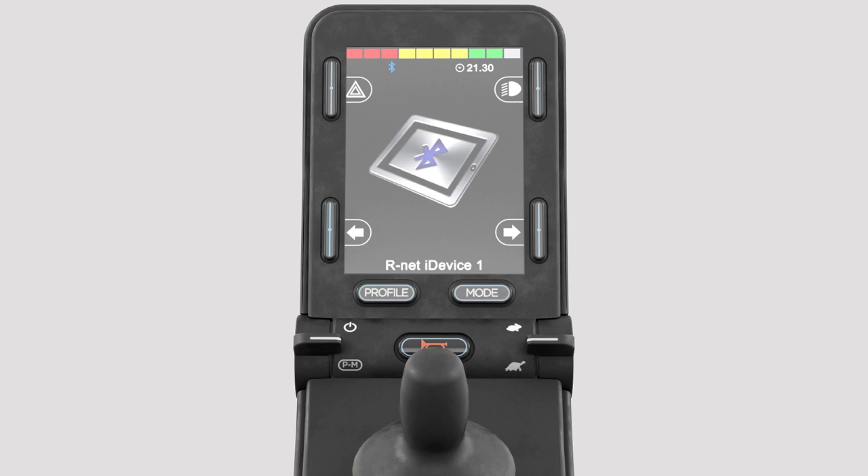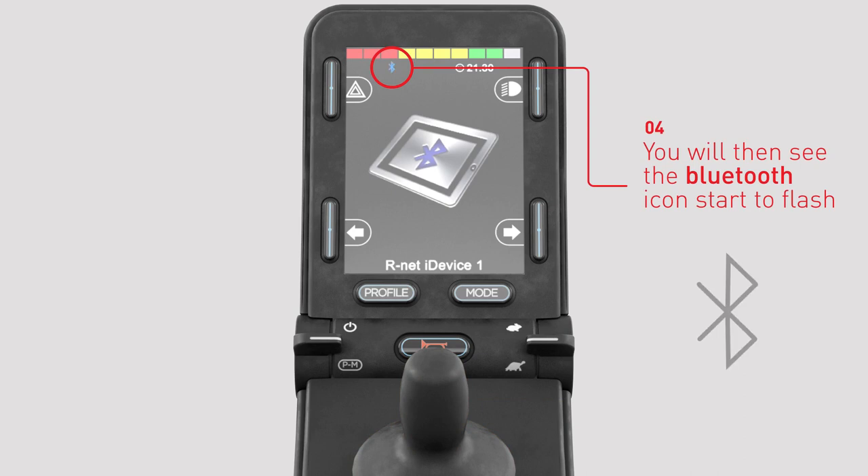The R-Net joystick module is now in discoverable mode. The Bluetooth icon will start to flash.